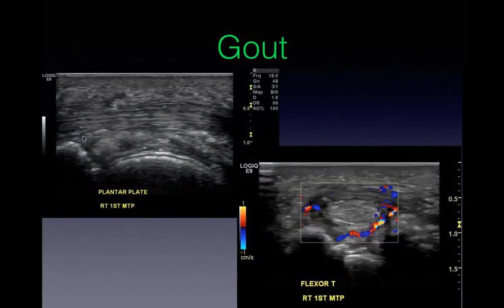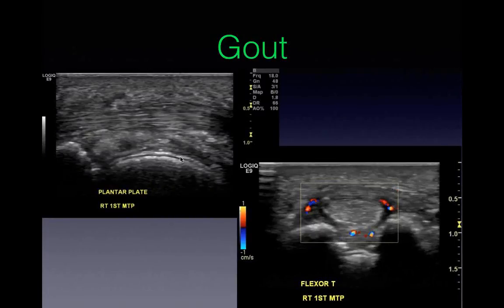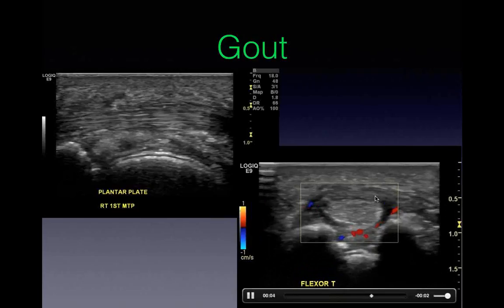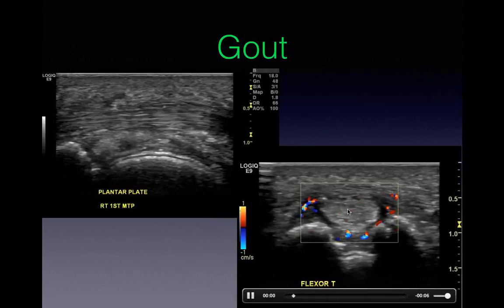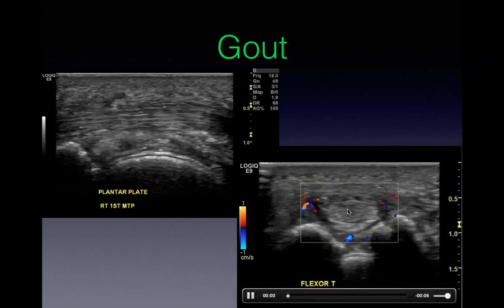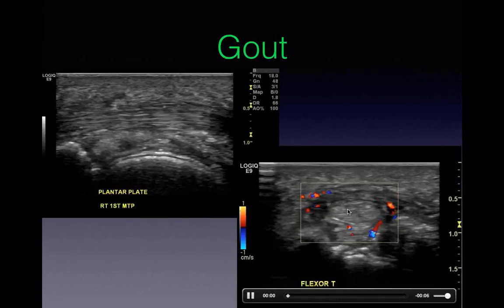Also have a look underneath the foot, not just the top. Looking under the plantar plate, you can see the double-line appearance of crystal deposition on top of the cartilage. You often see associated synovitis of the flexor tendons. If you imagine this was ECU of the wrist and you saw synovitis without trauma or repetitive overuse, you'd think systemic arthropathy. It's exactly the same in the foot - when you see tenosynovitis from around a joint, think systemic arthropathy. Be suspicious: gout, rheumatoid, psoriatic arthritis.